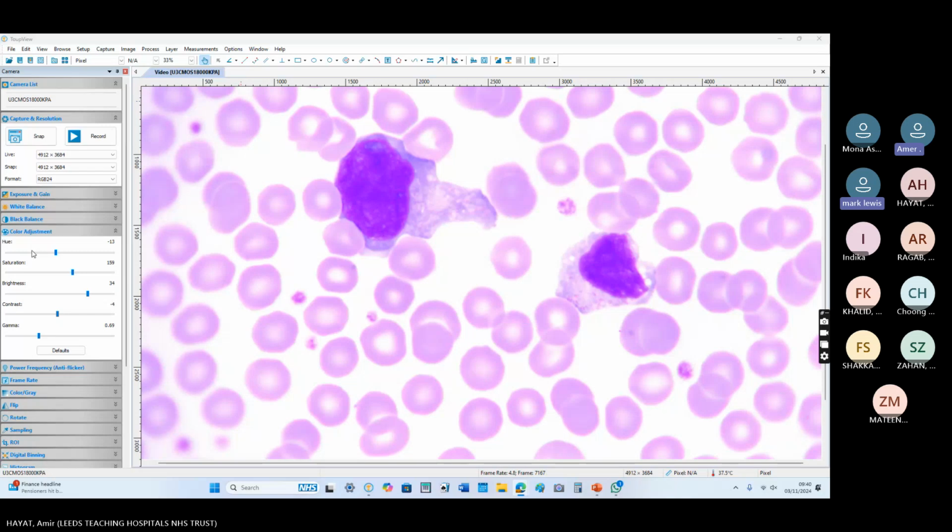This is a young patient. It looks as if it's quite reactive. It's molded around the red cells, and it's more atypical in shape. There are no clefts. I can't see clefts there. What is this phenomenon? Yeah, if they mold around the red cells, they're more reactive.